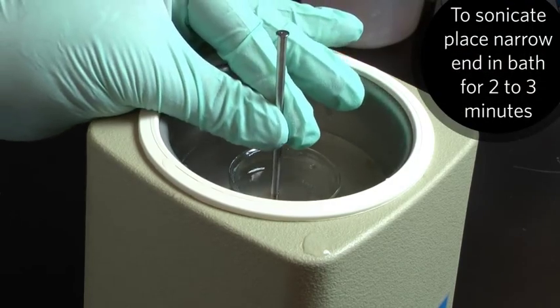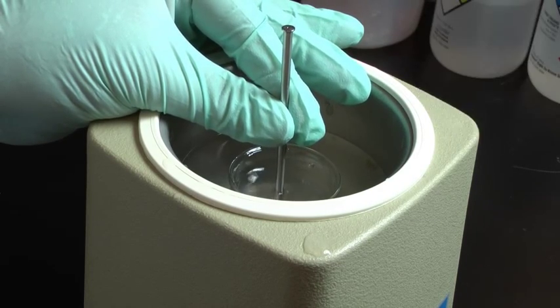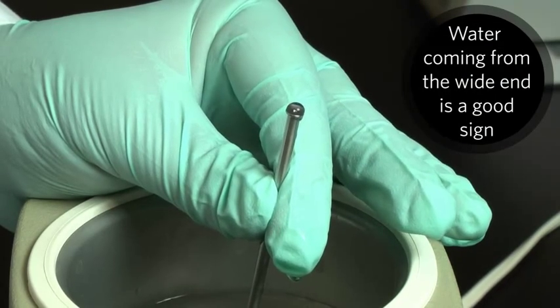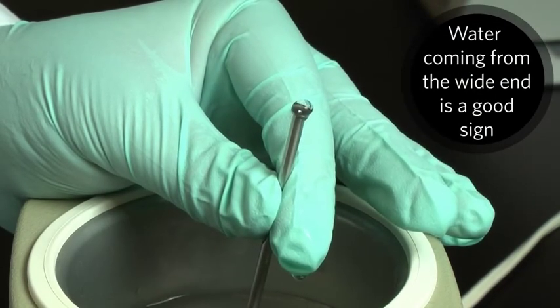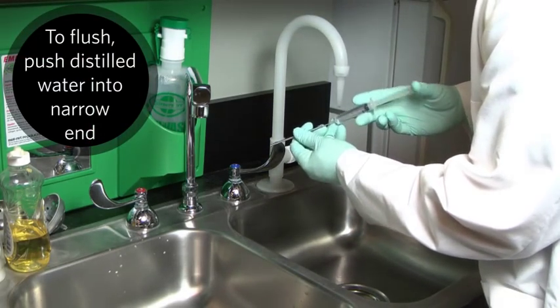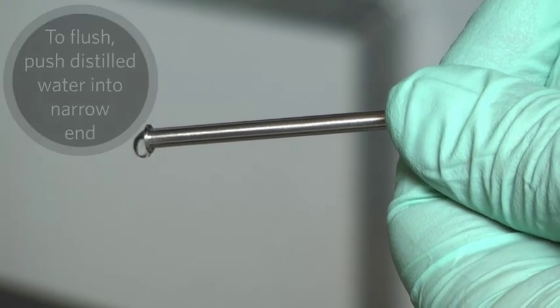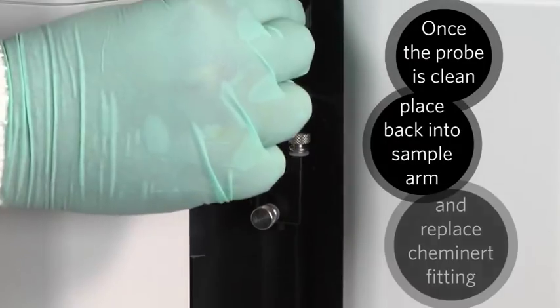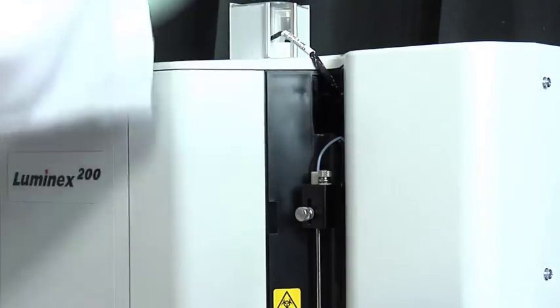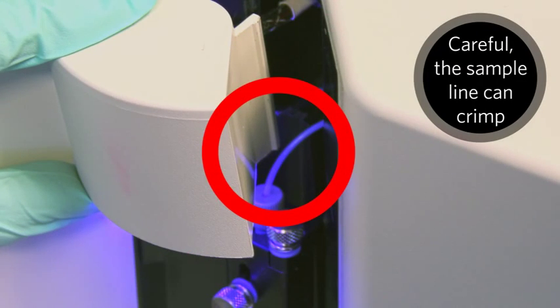To sonicate the sample probe, place the narrow end of the probe in a sonicating bath for two to three minutes. Keep the larger end out of the fluid. Seeing water dribble out of the wider end of the probe is a good indication the sonication is working. To flush the probe, fill a syringe with distilled water and push the water through the narrow end of the probe and out the larger end. Once the probe is clean, place it back into the sample arm and replace the Kaminart fitting. Note that the sample line can get crimped when replacing the light housing, so push the line aside.